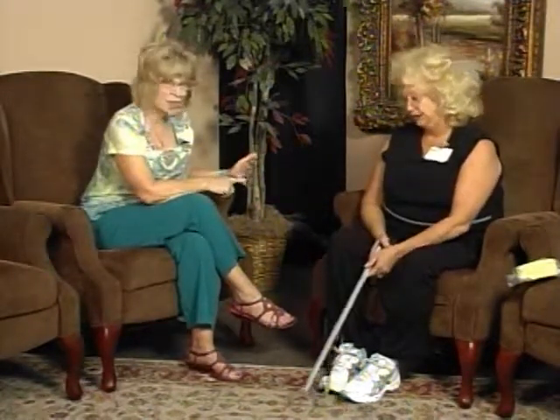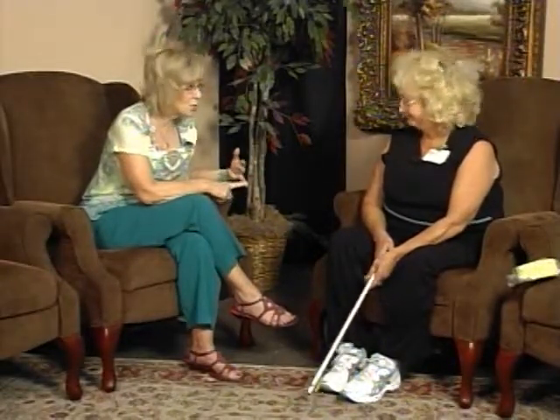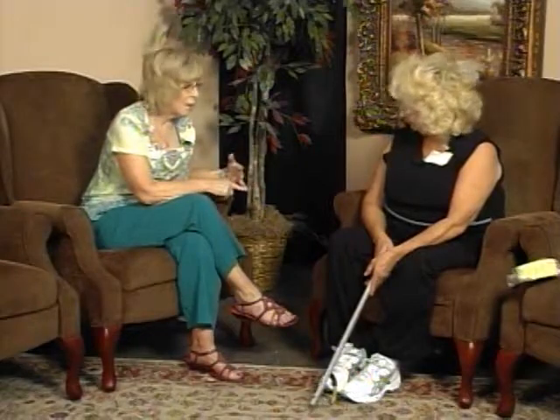You can retrieve from a cabinet. This is not rated for any big, heavy cans, but this would do a soup can. That would be wonderful, because so many people are getting on stools and shouldn't be. Maybe they have blood pressure issues, medication, so they don't need to be bending over. And they have vertigo. They look up, they get dizzy. They look down, they get dizzy. These are great tools to have to be able to do those retrievals.